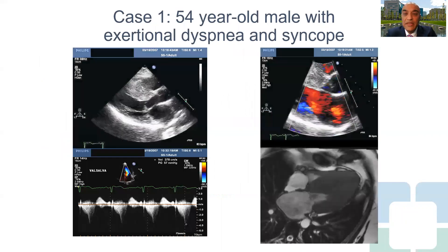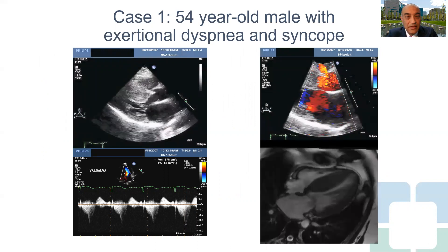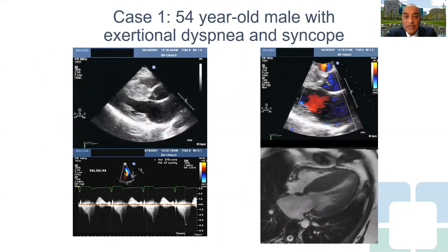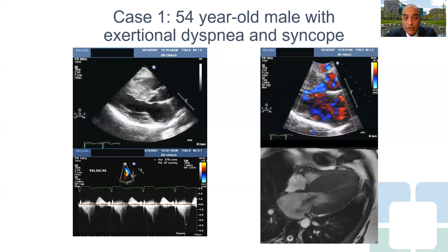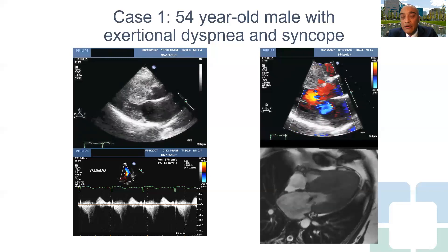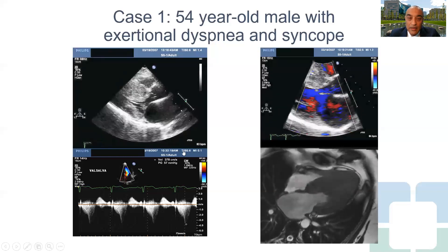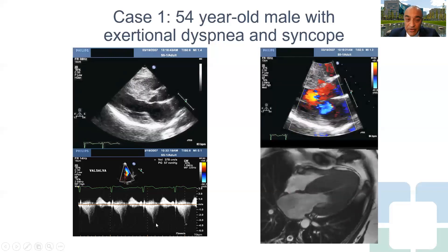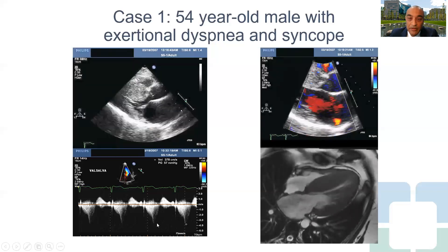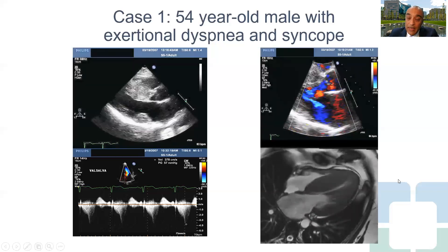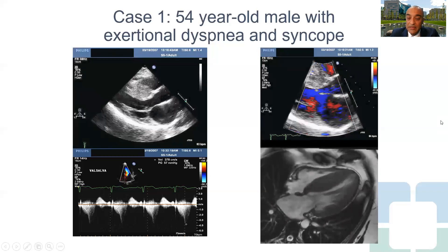Let's start with two examples. The first is a 54-year-old male with exertional dyspnea and syncope. As you can see in the four imaging panels, this patient has severe basal septal hypertrophy in the left upper column. In the right upper column, there is a lot of flow turbulence in the left ventricular outflow tract, resulting in a severe dynamic late-peaking outflow tract gradient reaching about 60 millimeters of mercury. The cardiac MRI in the bottom right panel confirms very severe basal septal hypertrophy.